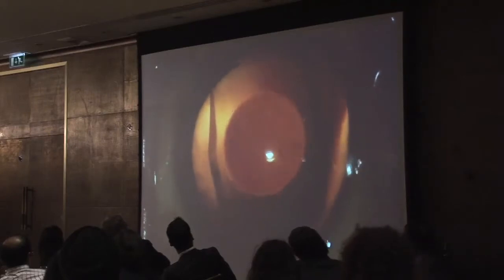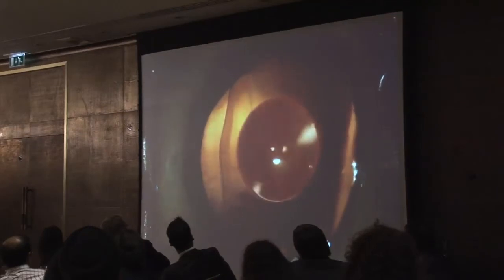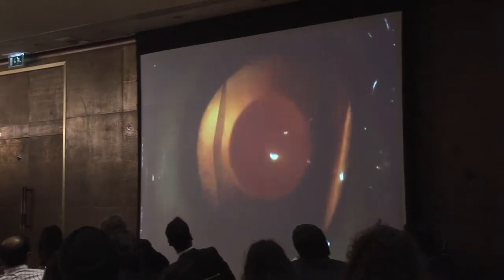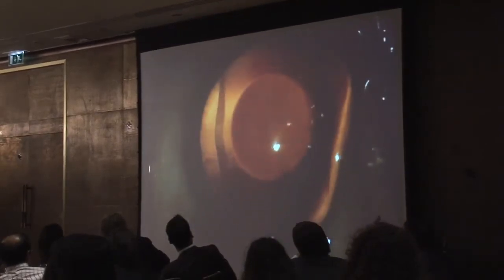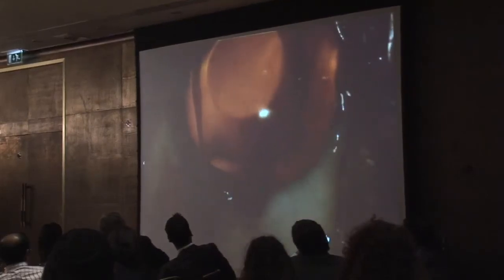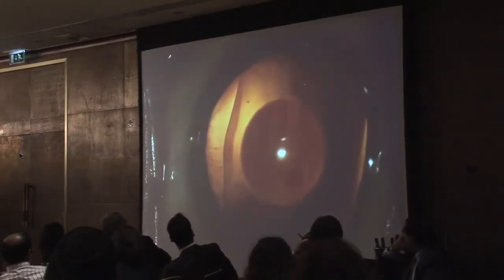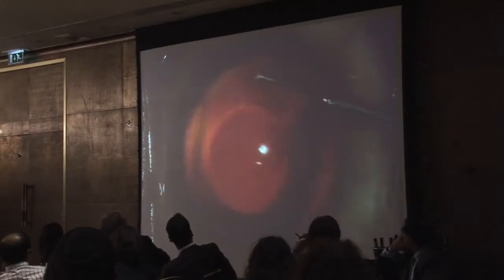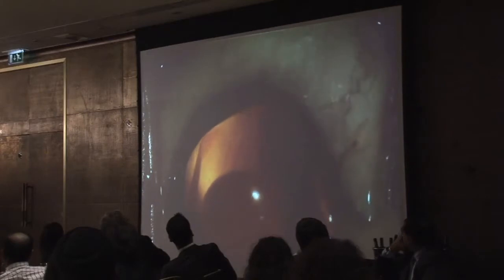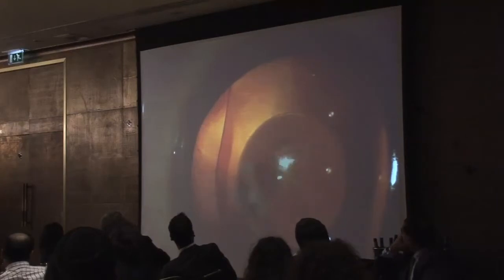With the toothed forceps and through the main incision, the proximal haptics are placed behind the iris. Make sure not to touch the optic part of the ICL because of the risk of touching the crystalline lens. Through the paracentesis, the distal haptics are then placed under the iris. Do this very gently and try not to touch iris or crystalline lens.